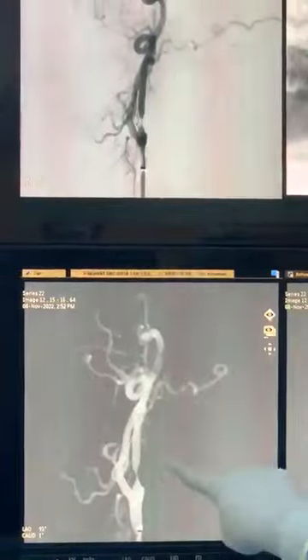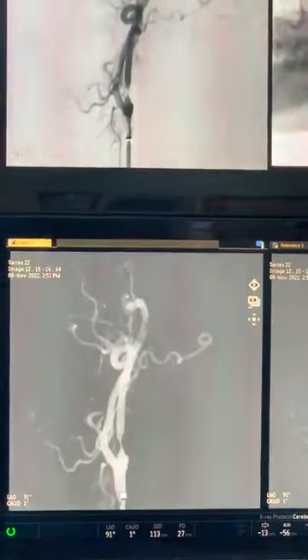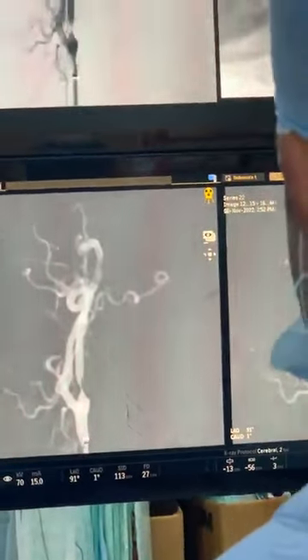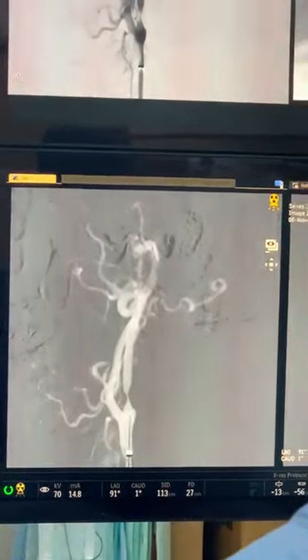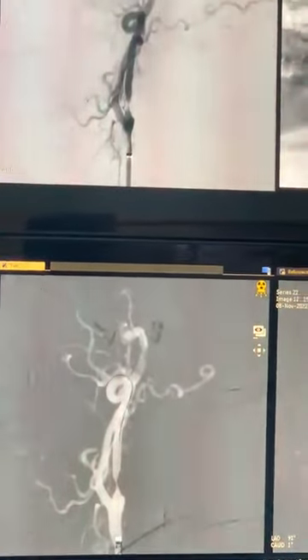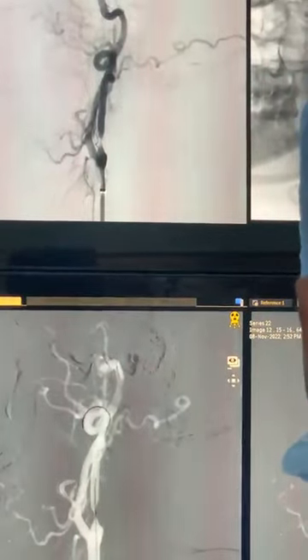So we can see the very critical stenosis of the internal carotid artery. We will try to navigate. Can I have a screen to also prove for start? All right. So this can be said as a 99% stenosis, very thin.